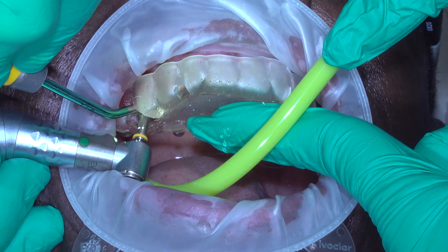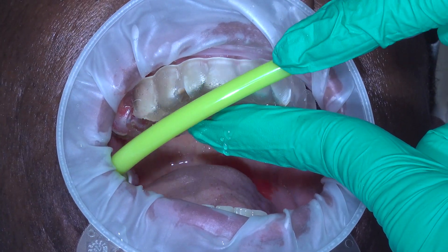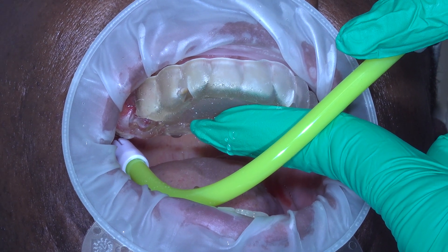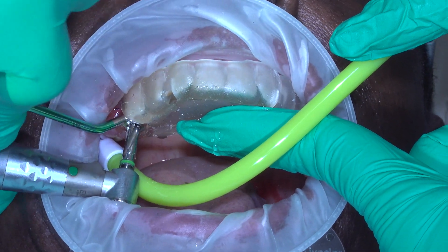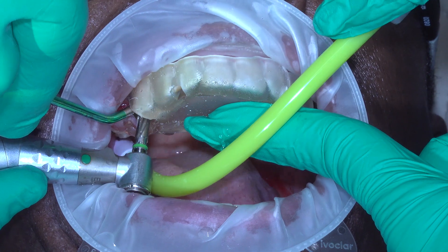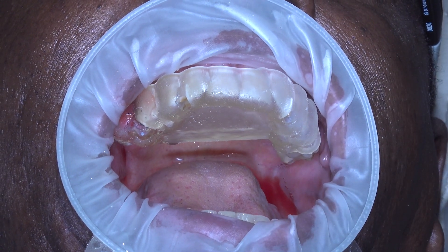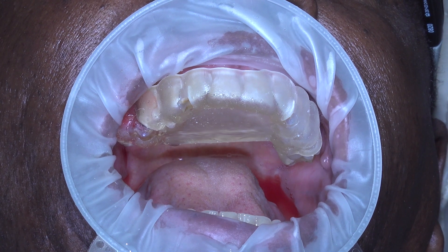We're setting the 2.5 drill in place — in and out. And if you see pink bone on your flutes, you know you've got good bone. Now we've picked up the 3rd drill, and the 3rd drill usually goes even faster than the first two. Watch how fast this drill is — in and out. Pink bone is an indicator that you have bleeding in the bone, which means you're engaging some trabecular bone, which is a good thing because bleeding is the first step to healing.